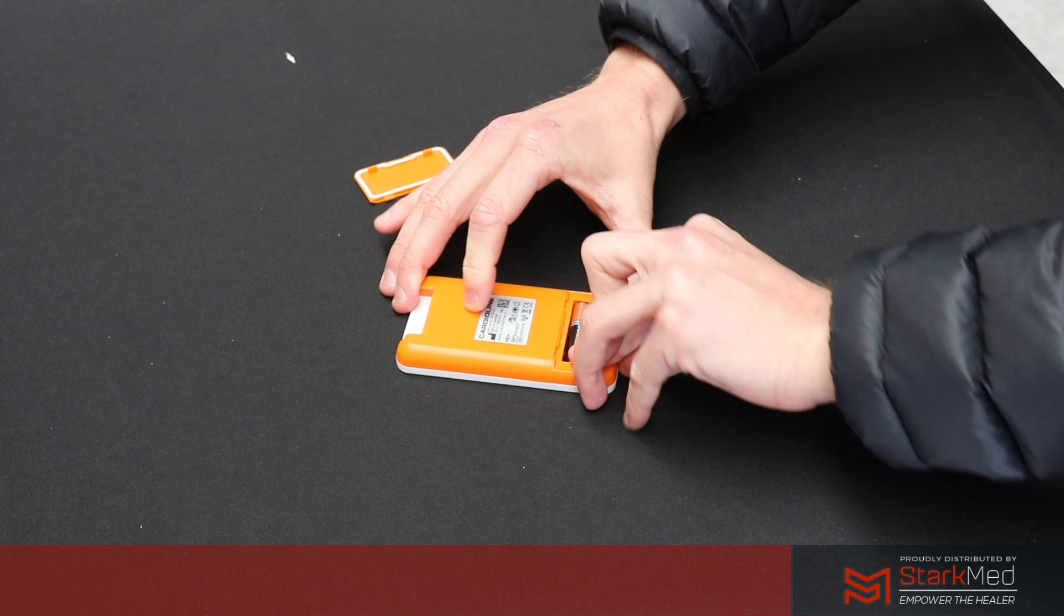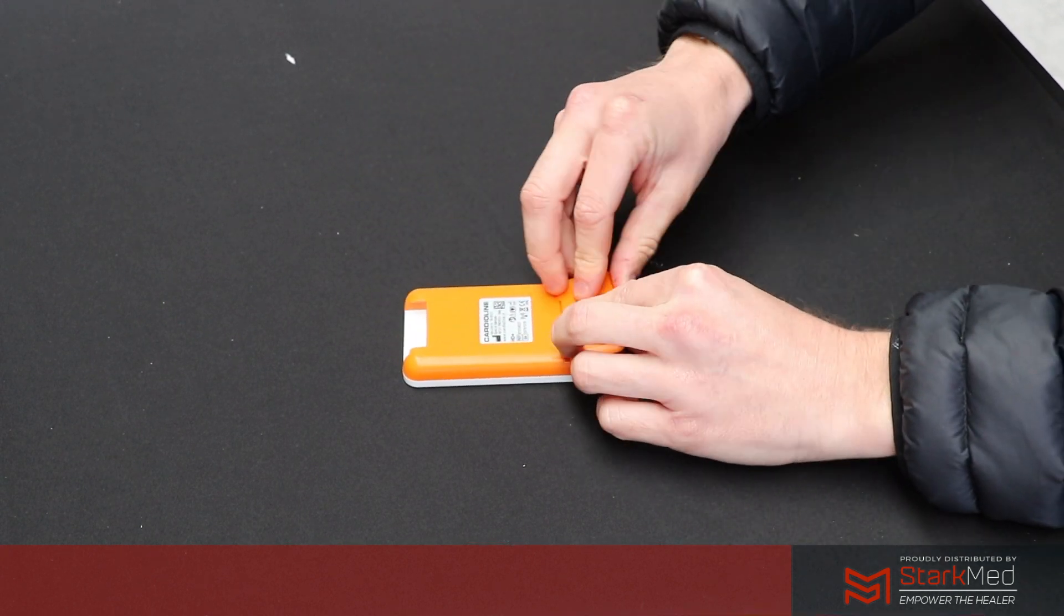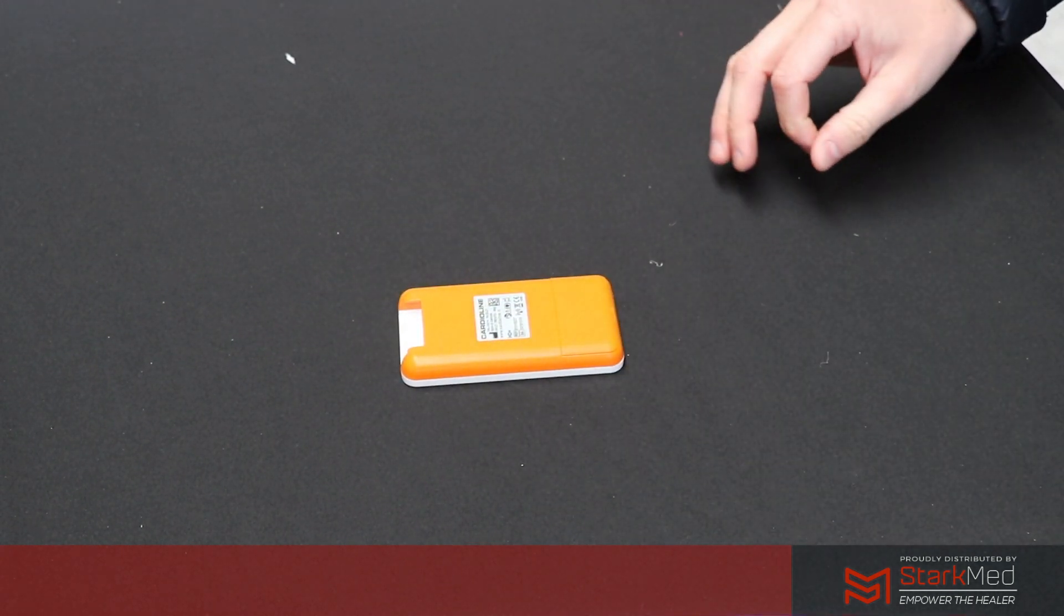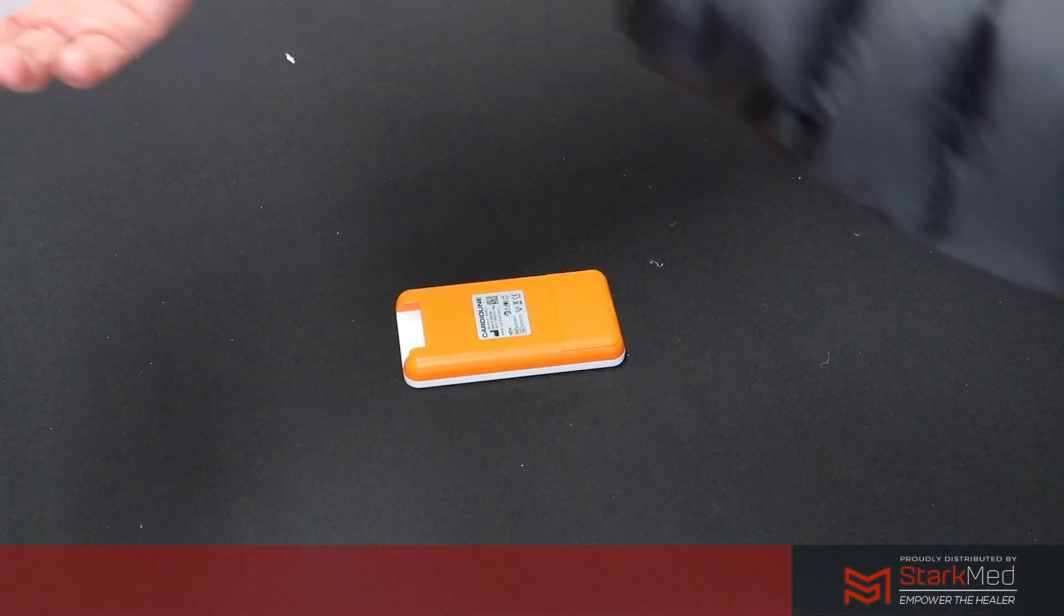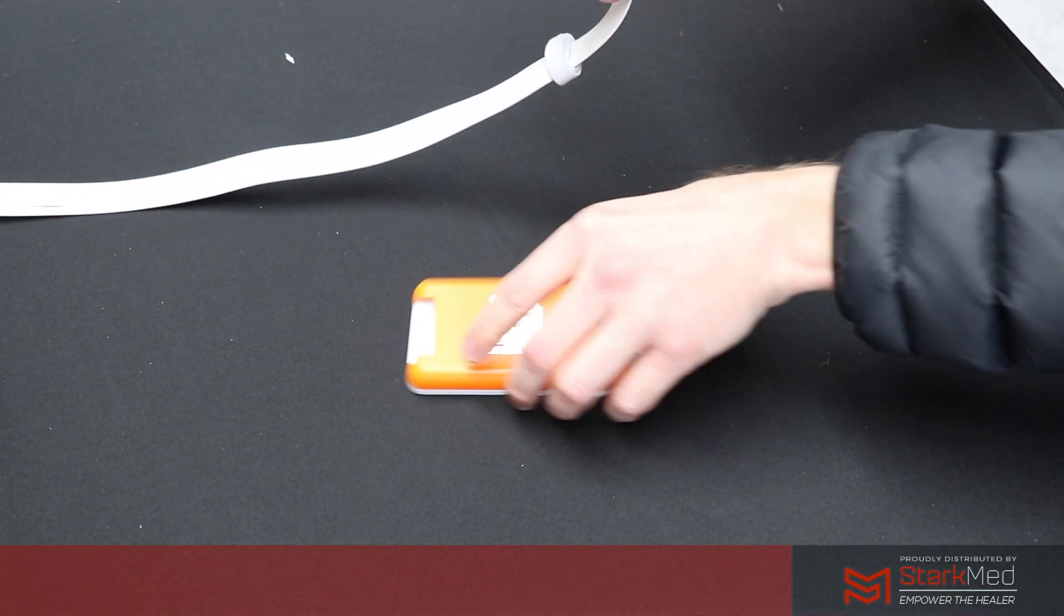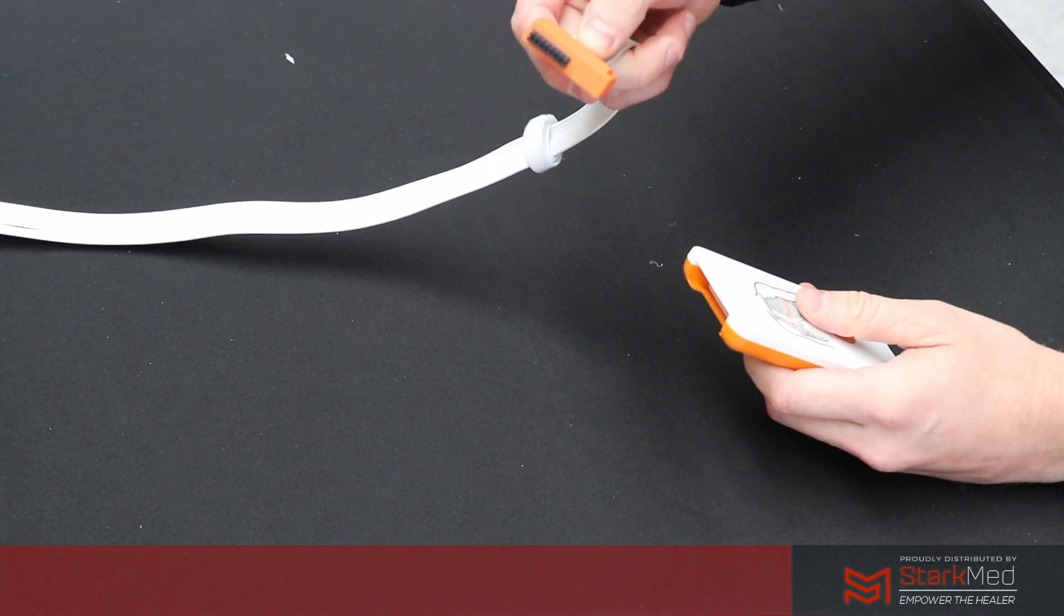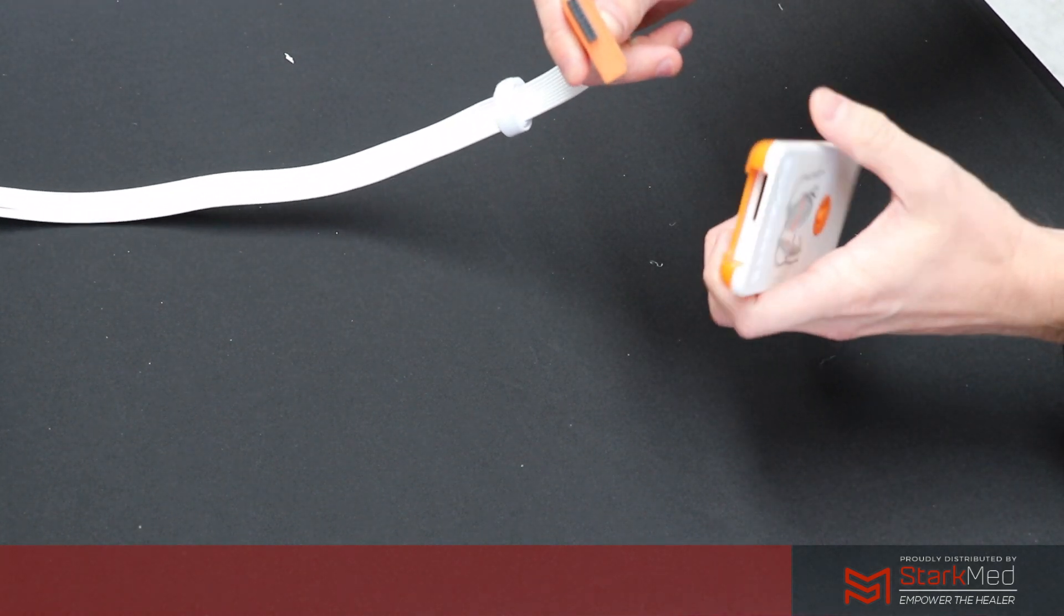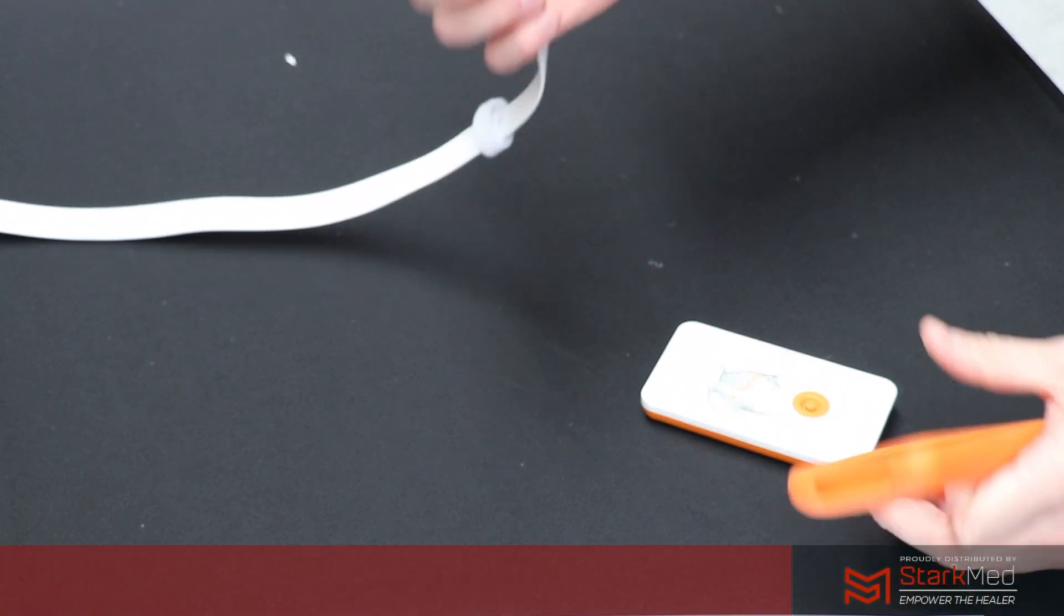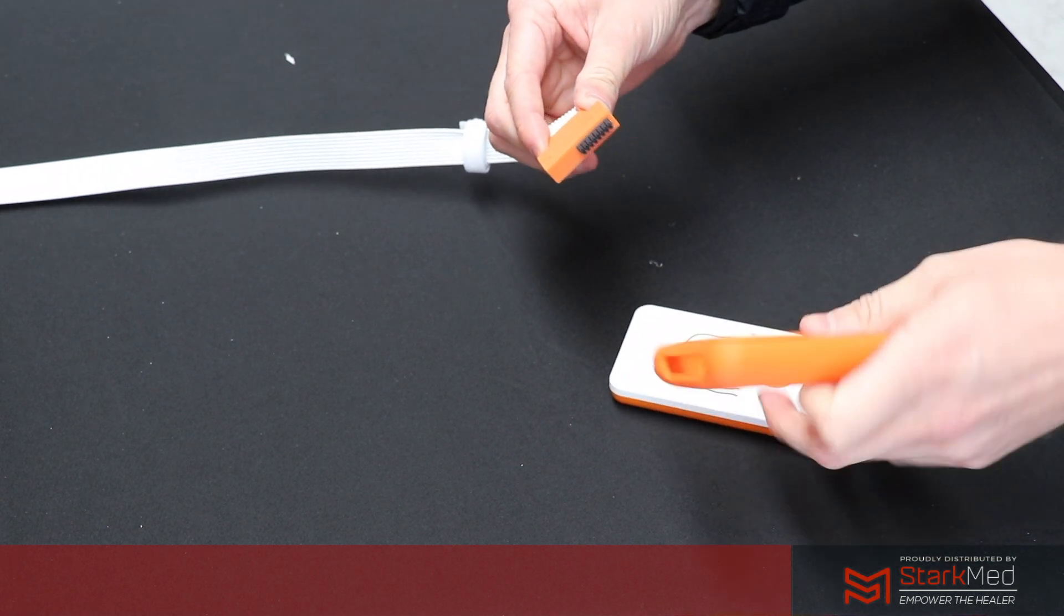Now you'll notice your patient cables have a proprietary clip and it's only going to go into the device one way. But before you place this into your acquisition unit, we're going to put the patient cables through the silicon casing.